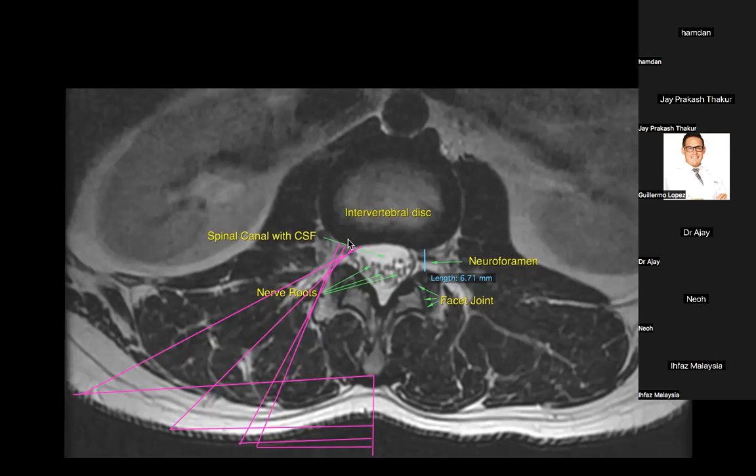So whenever you have this foraminal herniation or the paracentral herniation, what happens? What will happen to this dura? Dura is pushed. So suppose it is like this. Dura is already pushed over here, so you have a good room to enter inside. Now you know you have a good margin here. Here I do not have any dura. I do not have any traversing root here. It will also give you some confidence that there is nothing inside here. This part is filled with the nucleus material, with the extruded material, because my dura is pushed here. This will also help you in deciding the side.